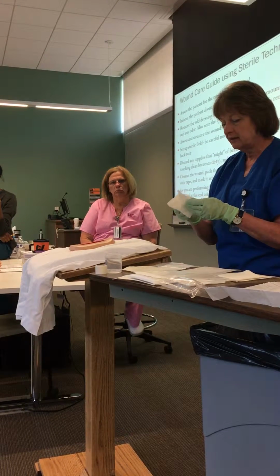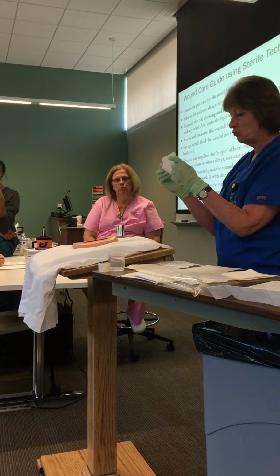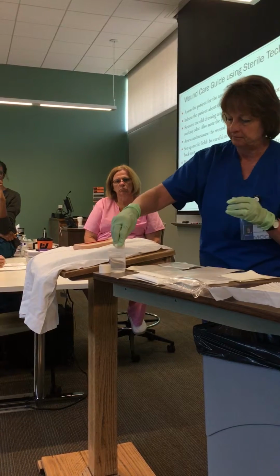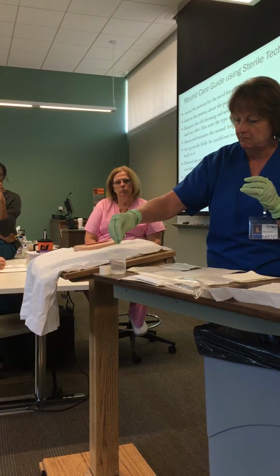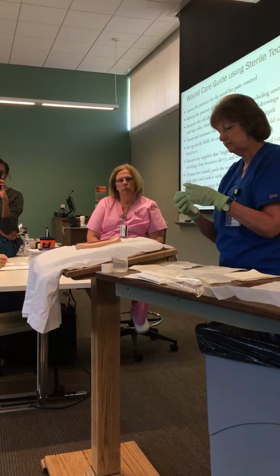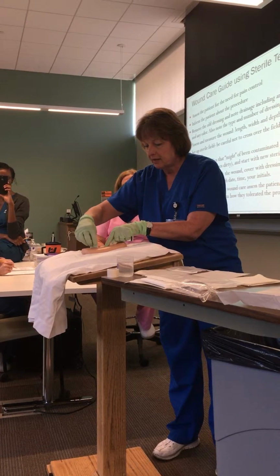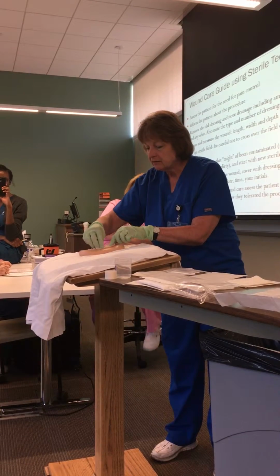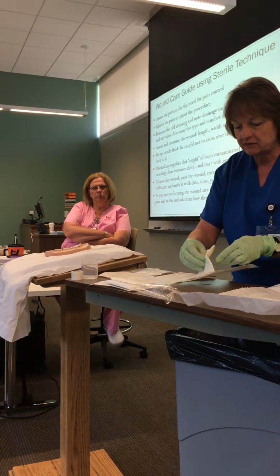So now the next one I'm going to have to pack into the wound. So I want to expand it first, because once you get this wet, it's really hard to pick at it to get it open. And then I'll crunch it up, and I'll put it in my solution. Get it nice and wet. Okay. And I'll open it up. And I want to lightly pack this in the wound. Okay, so I'm going to lightly pack in the wound. And this is a little bit more shallow, but the wounds we have in the Bellmans will take 2 of these gauze.